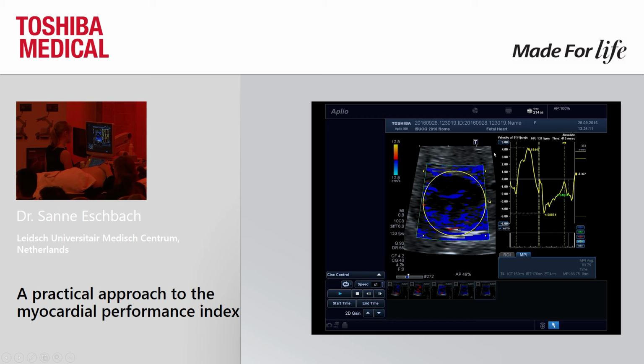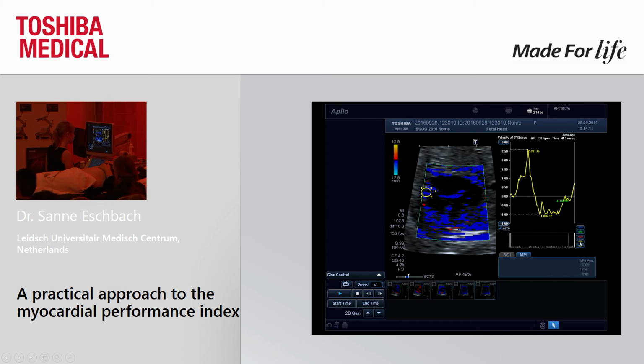The spine of the baby was here, the abdomen was here. This is the right side of the heart, this is the left side of the heart. Let's see if we can also get the image on the right ventricular wall, just below the valve. That's a little bit more difficult in this fetus. Again, I just try to find the right spot just below the valves.